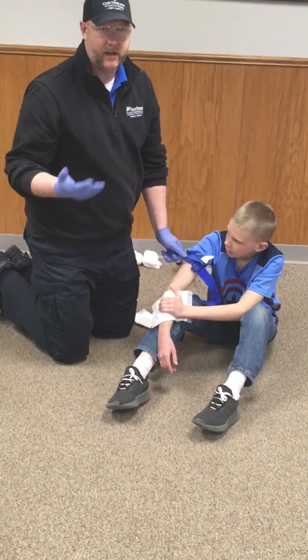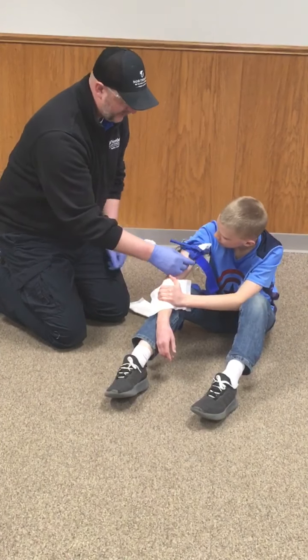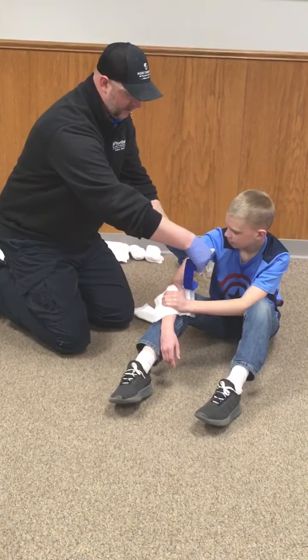The evaluator will tell you the bleeding has now been controlled. Lock your windlass in place, take your tail, bring it through the windlass catch, and then take your white tab and go over. Anytime we have a tourniquet application, we should record the time and consider putting a 'T' on the patient. For the skill station, they're not going to have you actually write on the equipment.